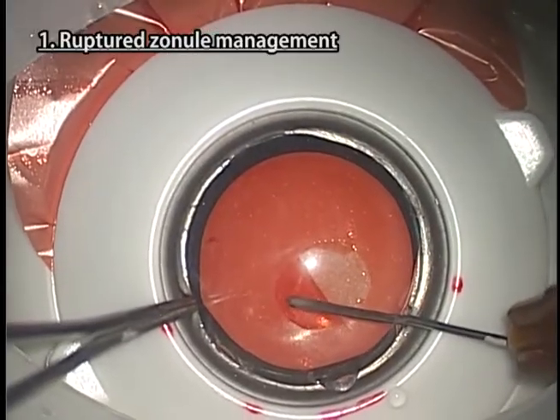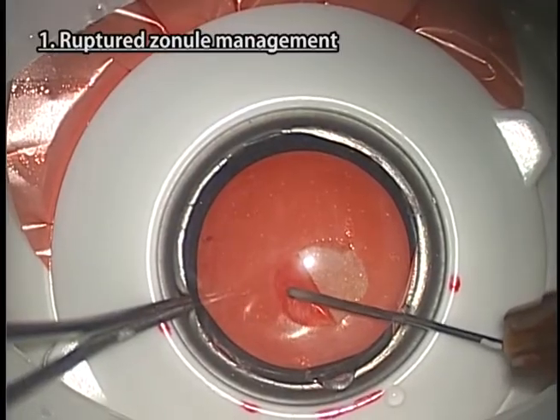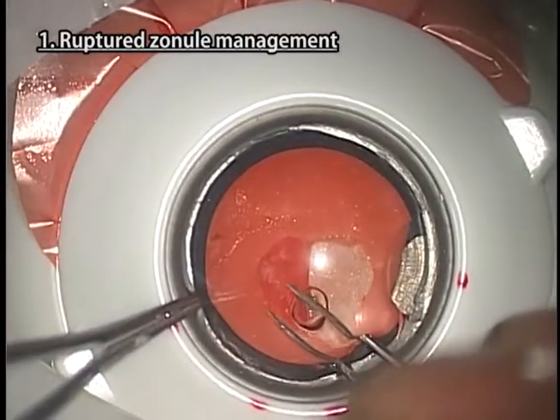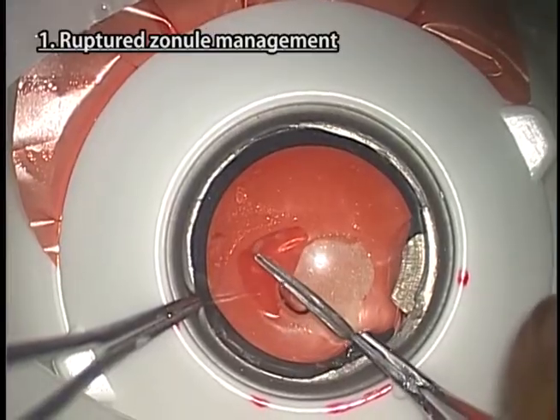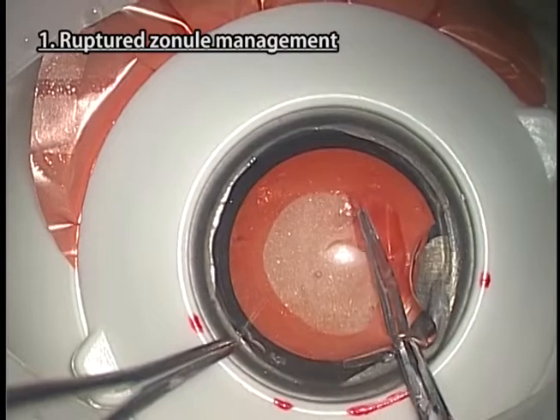Capsulorhexis using a cystotome is difficult. Complete capsulorhexis by changing the instrument to forceps.